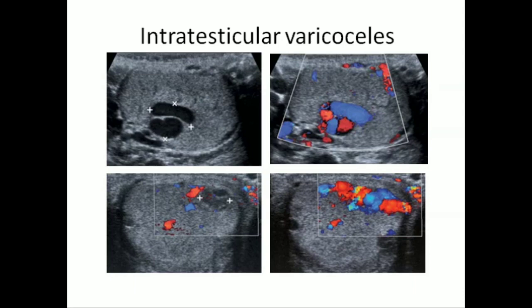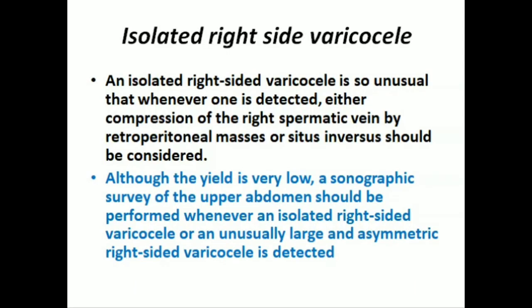These are intratesticular varicoceles appearing as cystic masses; with color Doppler they show good flow. This is another solid mass appearance of varicocele — with Valsalva it shows increased blood flow. Isolated right-sided varicocele is unusual, and whenever one is detected, either compression of the right spermatic vein by retroperitoneal masses or situs inversus should be considered. Although the yield is low, a sonographic survey of the upper abdomen should be performed whenever an isolated right-sided varicocele or an unusually large and asymmetrical right-sided varicocele is detected.